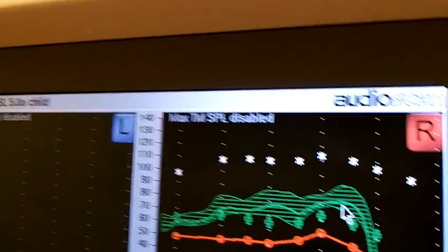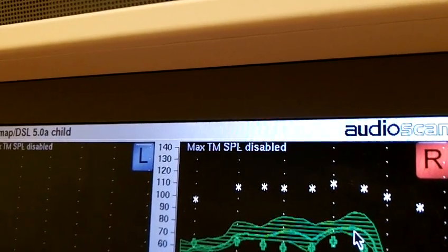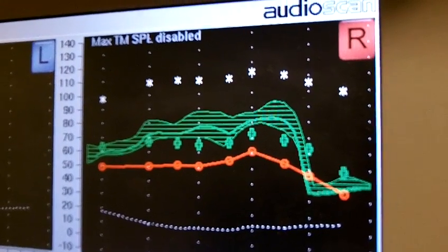So what we're going to do is go over to the software and go down by quite a bit, and we're going to run it again. So I'm going to push the number 1 again and it's going to start over.